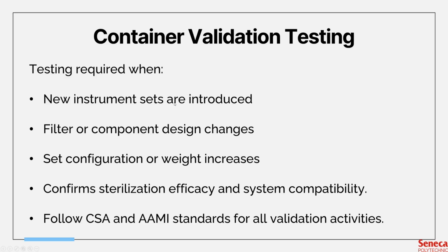You would have to make sure that its layout works properly to allow sterilant penetration. If it's multiple levels of trays, you would have to test those too. Everything has to be accounted for. So validation testing verifies both sterilization efficacy and system compatibility.